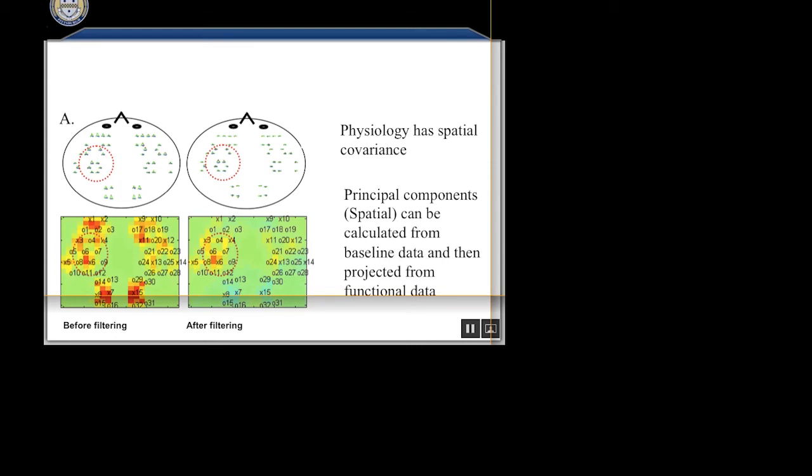The other problem is it works really well if your probe is large. In this case, my probe is the entire head. Cardiac is moving the entire probe, and I have a lot of channels where I didn't expect any brain activity. And I'm using the fact that it showed up in those channels to know it probably wasn't brain activity.